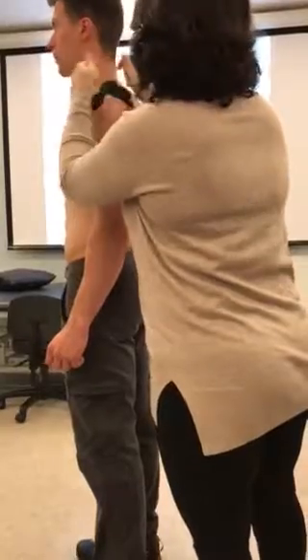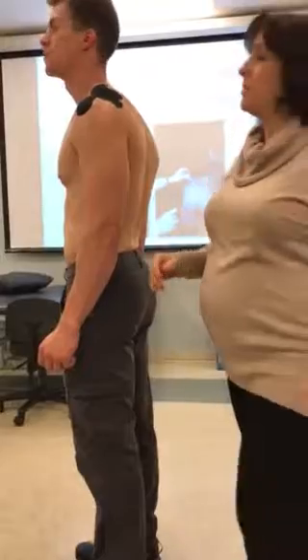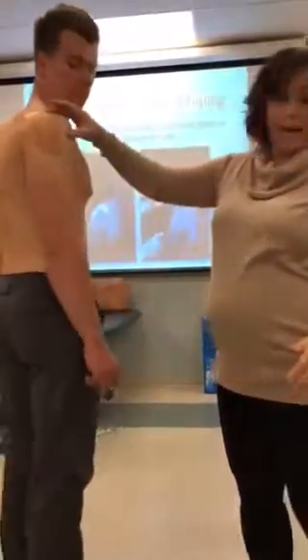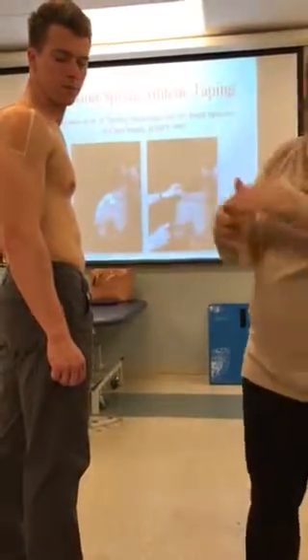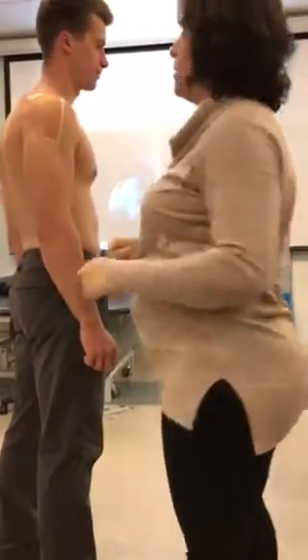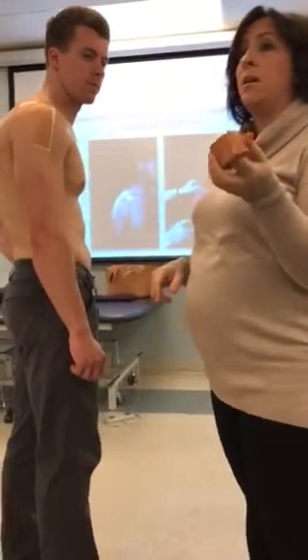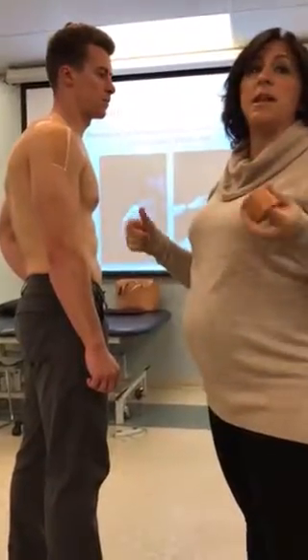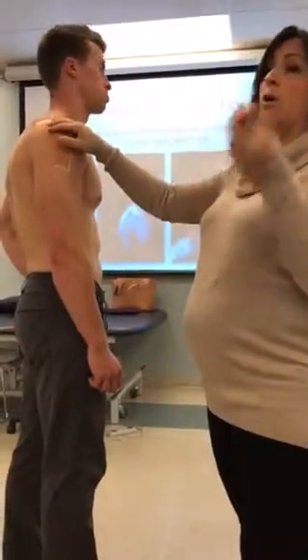How come you don't do the star with, like, the leukotape? You could. That would be acceptable. You could do it here, and if I felt like I didn't have enough, you're not wrong to say, let's add more, keep pressing it down and then do another piece. Remember, this leukotape can go on the skin. It's just usually more customary to protect the skin in case it shears off and lacerates the skin.